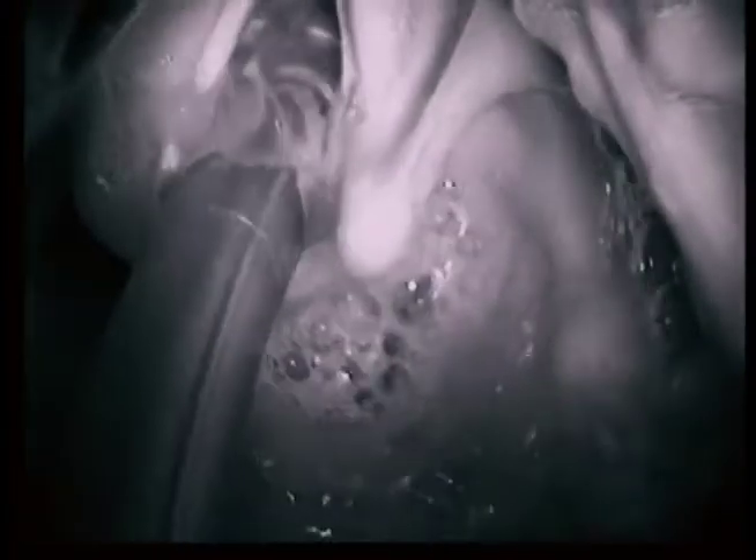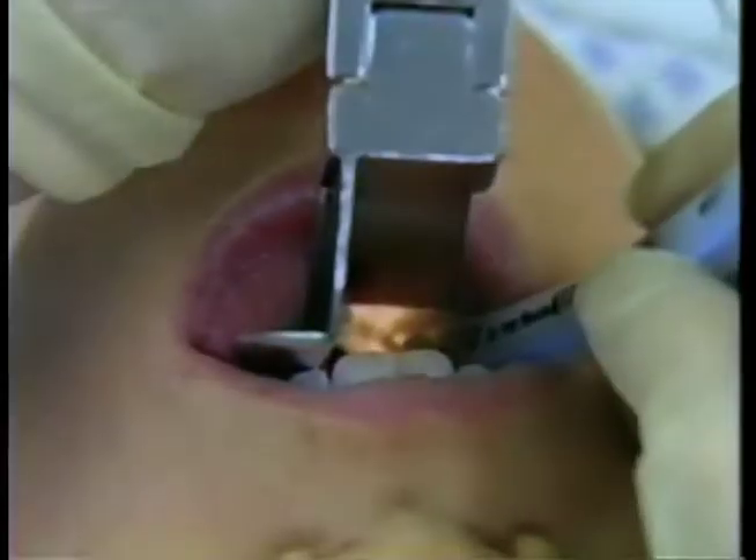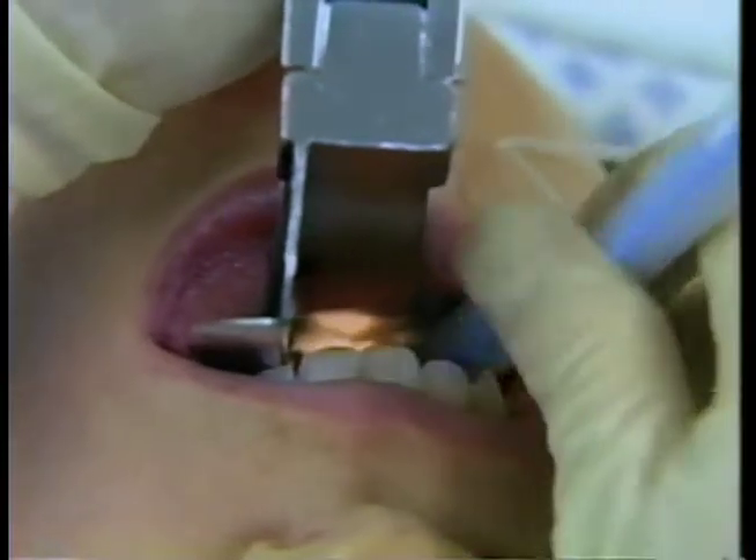Let's watch this clip again. Notice that, as sometimes happens, the tube had to be redirected to line it up with the opening. You need to be gentle, as forcefully bumping into the larynx multiple times might cause trauma, bleeding, or swelling. Stop advancing when the cuff is beyond the cords.